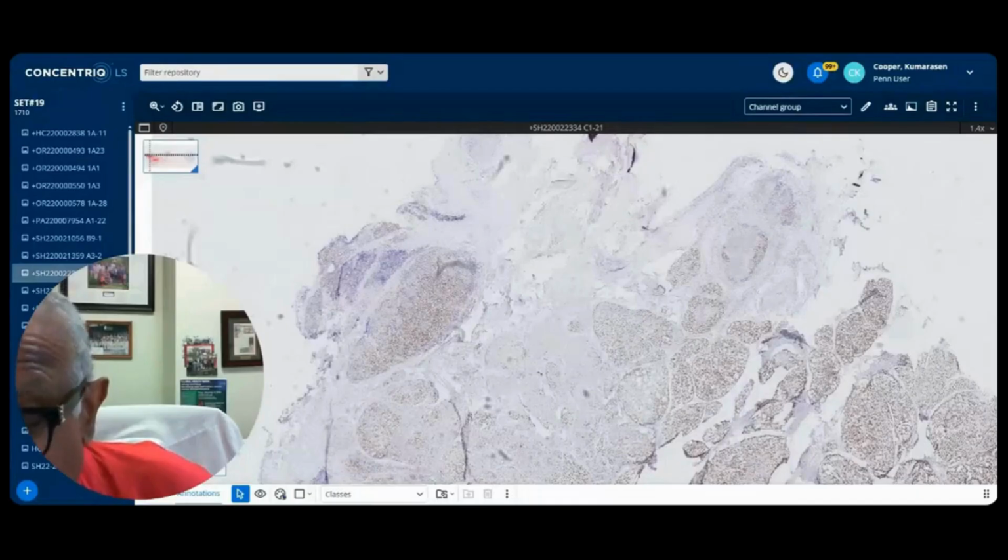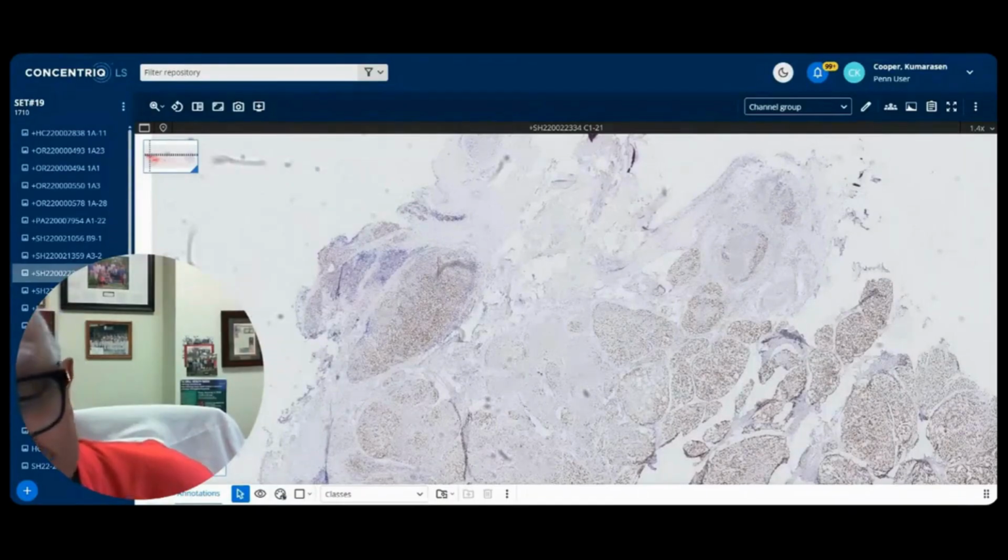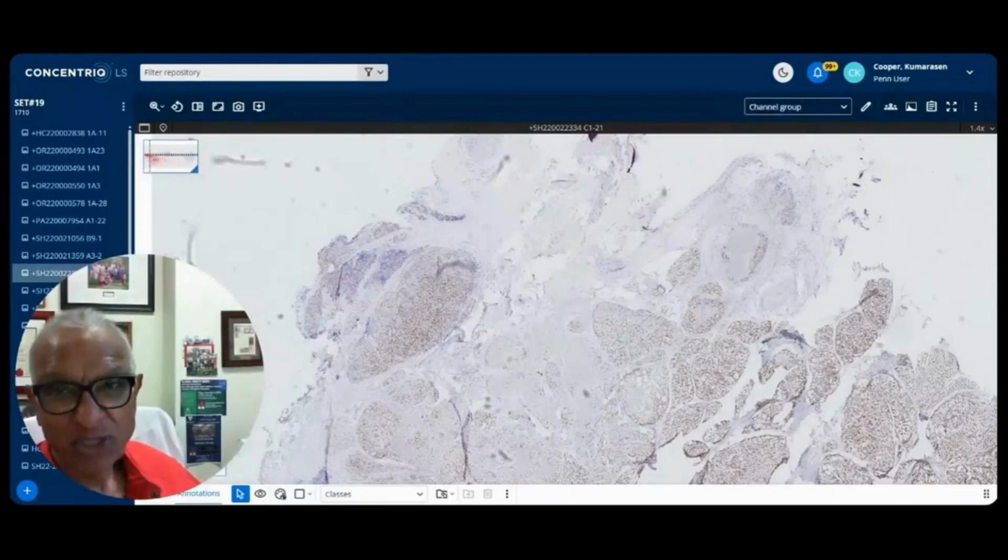Yes, it does work, Tom. In my limited experience, I've probably seen a small handful in the last few years, and it does work. The other point I was going to talk about, Madhu, I thought it was a thick section, beautiful amphophilic. Does work. Okay, just catching up with my chat.